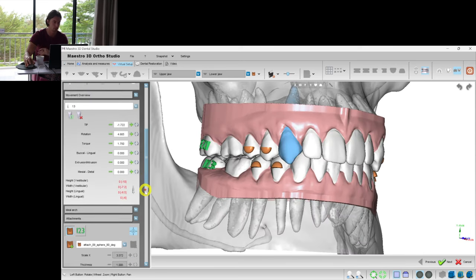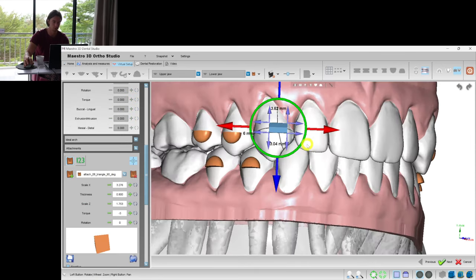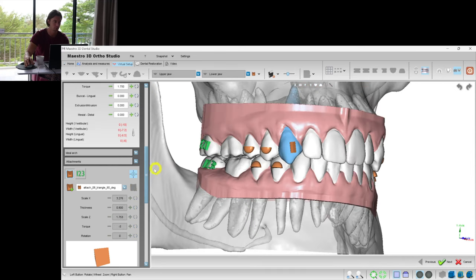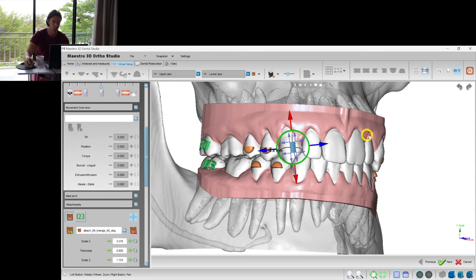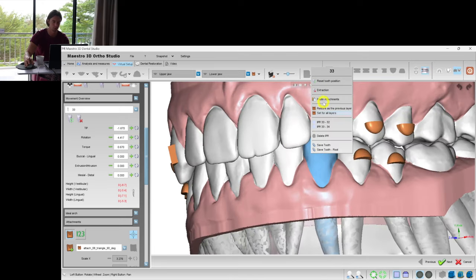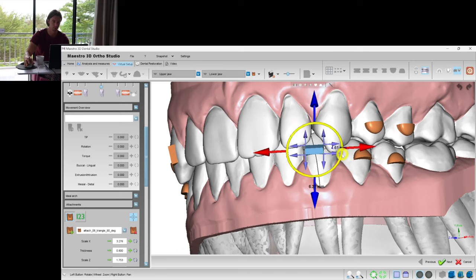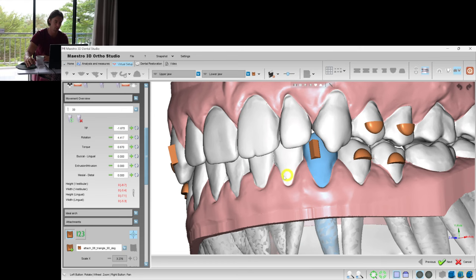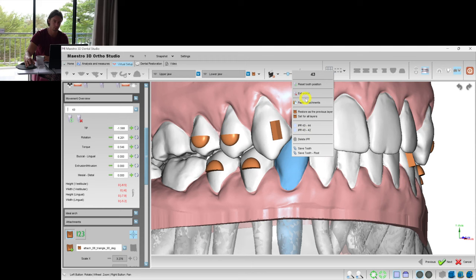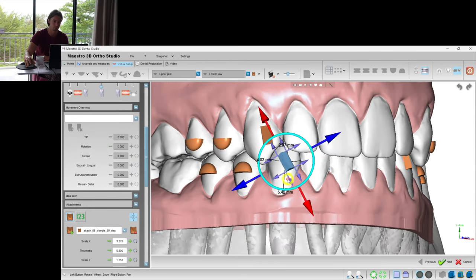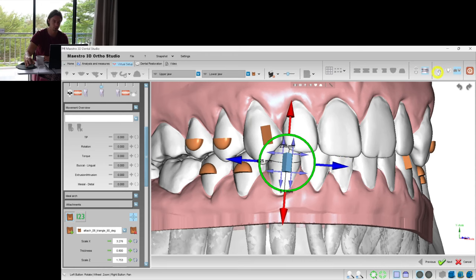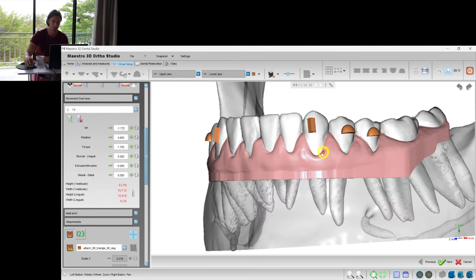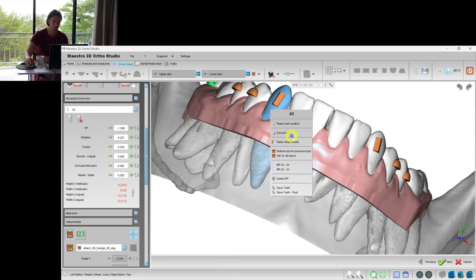So let's add those attachments. I'm used to using this kind of shape, the triangular. Here we see the mesial rotation, so we put it to the mesial part. Here is the same. If I would see the minus here, it's going to be a distal rotation. But here we see that it's a mesial rotation, so we put the attachments to the mesial part of the crown. Not forget to set those attachments for all the layers.